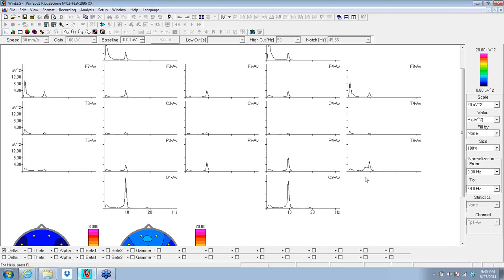It's responsible for social perceptual skills. It's seen in Asperger's, which is now not a category in the DSM-5. It was one of the useful ones, I thought, in the DSM-4, but there it went. Autism spectrum disorder with social perceptual deficits. But it's also seen in reactive attachment disorder. It's also seen in PTSD and significant trauma cases. So the impact on affective perception. This area perceives facial expression, body language, that sort of thing, and the emotional tone of speech, the song of speech. So this area is not working like it should. It has the dominant alpha peak in it, but it has the slow alpha focus in it specifically.